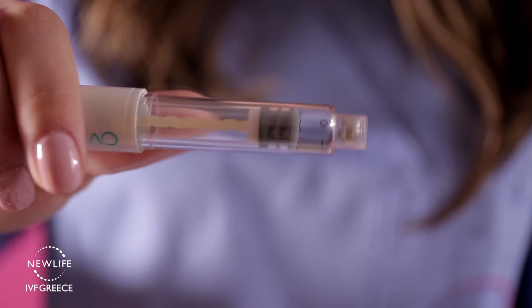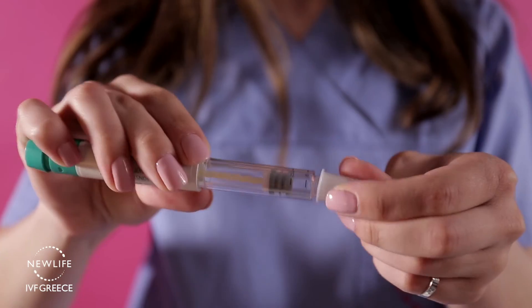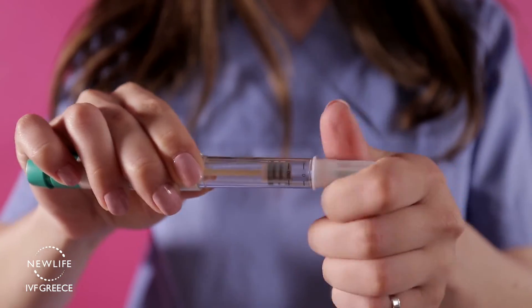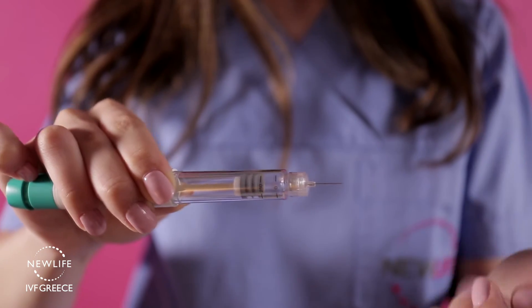Remove the pen cap. Take the needle and remove the peel-off seal from the add-on needle cap, then screw the needle onto the end of the pen. Next, carefully remove the external cover from the needle and then the internal protection cover.